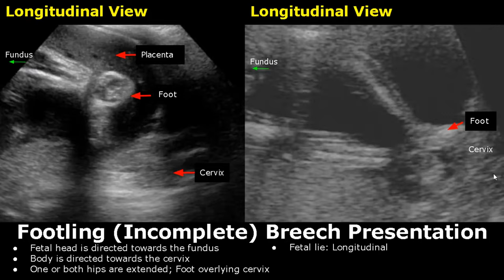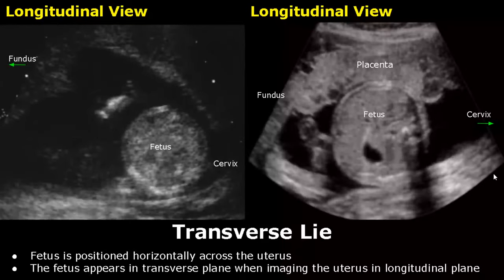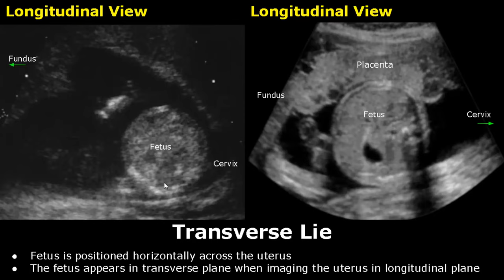In a transverse lie, the fetus is positioned horizontally across the uterus. Although this is a longitudinal view of the uterus, the fetus is seen in a transverse orientation, confirming that this is a transverse lie.